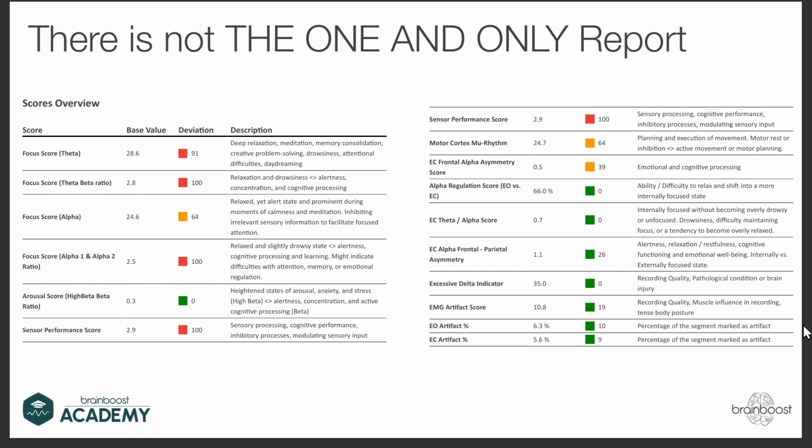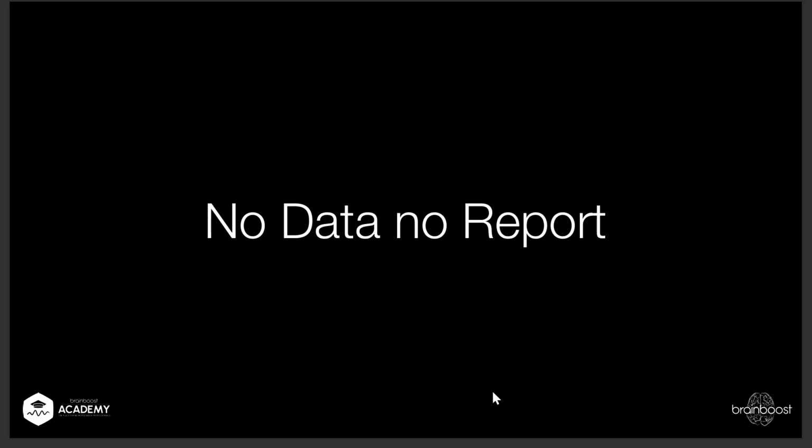And one very important thing: when people say, okay, I have this software and I have the other software, and they pop out all these different reports, there's not the one and only report. These reports, I think, are pretty nice. Of course, we're working on other categories as well, and it also depends on whether the client is in a good mood today or very tired. Then the results will vary a lot. But here you can get a pretty decent report. Try it yourself. But very important, if there's no data, there's no report.